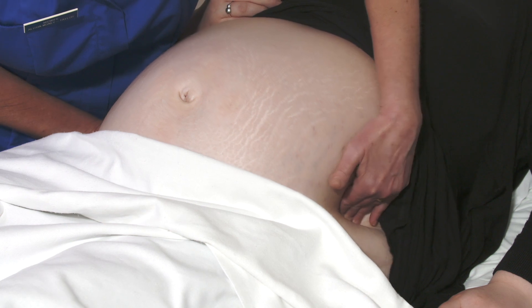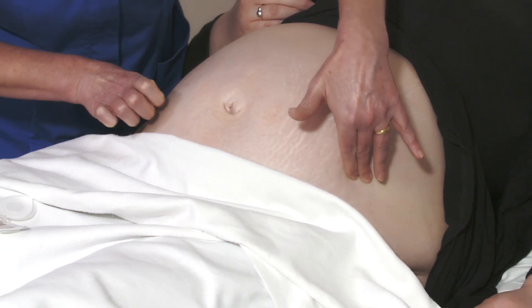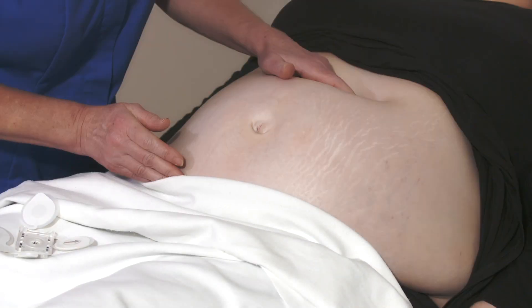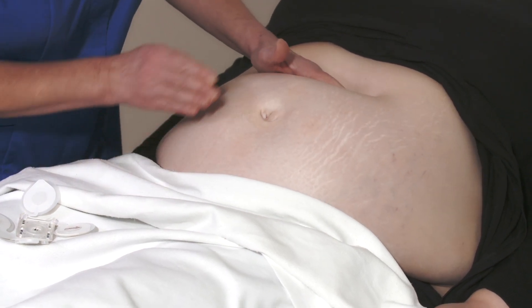Alternately, if you can palpate the iliac crests, then the line touching the tips of the iliac crests and where it intersects the midline is an alternative approach. Again, in this patient, the umbilicus is not displaced, so no need to make an adjustment.